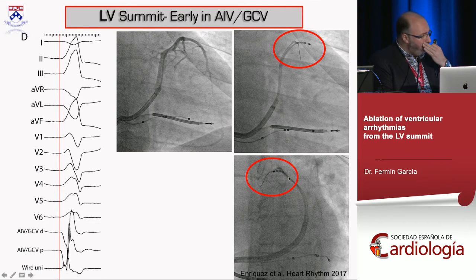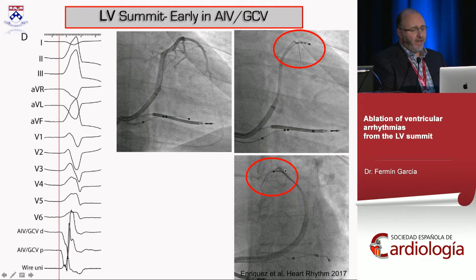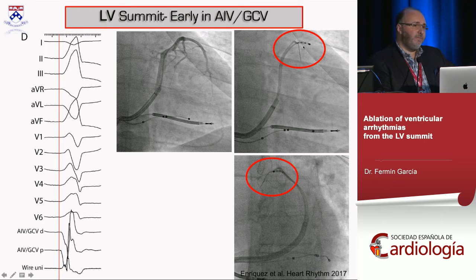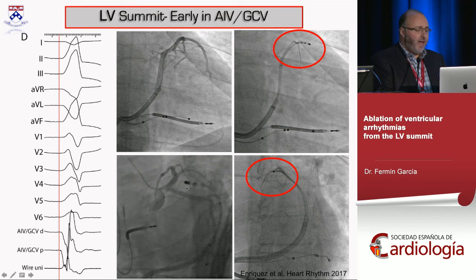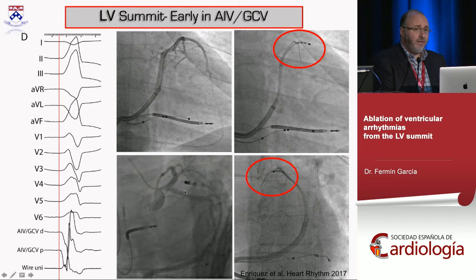For an LV summit PVC, after confirming EKG characteristics, we do the venogram, then place a mapping catheter — quadripolar or decapolar — through the agilis sheath into the great cardiac vein or AIV, and put a wire inside one or two branches to look at activation. In this case, activation is earlier on the epicardial aspect than the intramural aspect, so we attempt ablation there. We then check coronary angiograms — if far from any arterial circulation, you may be able to ablate from the vein easily.